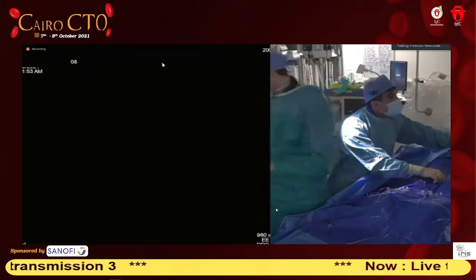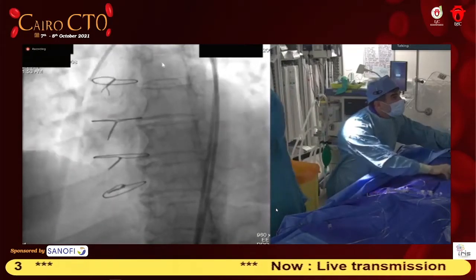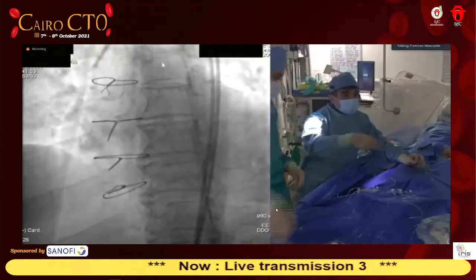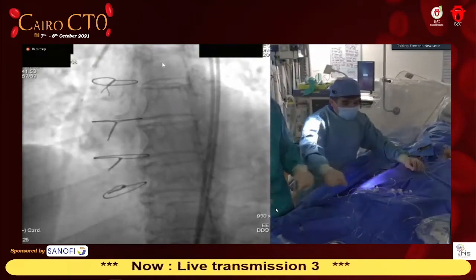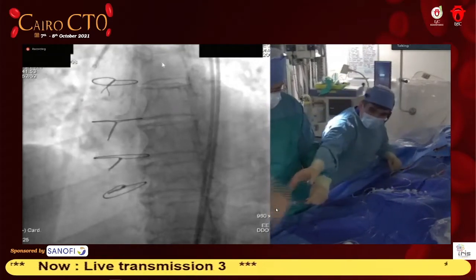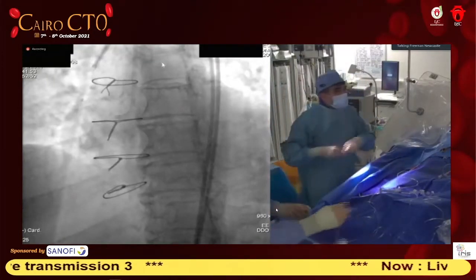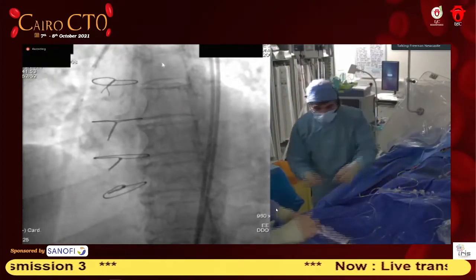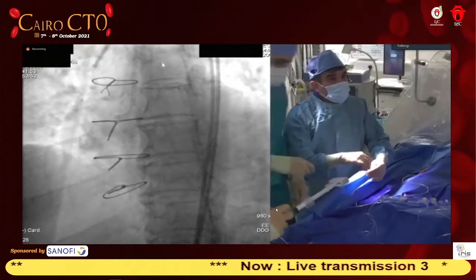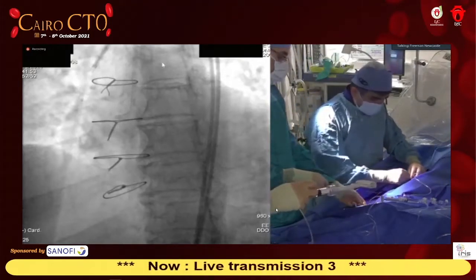I'm going to leave this in now. I'll leave this out for the time being. Take this away from me. So now it's a normal angioplasty. We'll open it up and then we measure, see what size it is. I'll take the balloon. I usually dilate with a non-compliant balloon. So if you show me the cranial view roadmap, please, David. Heart rate has recovered now, the wire is out and the blood is flowing.